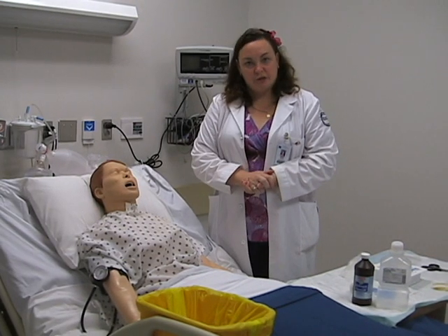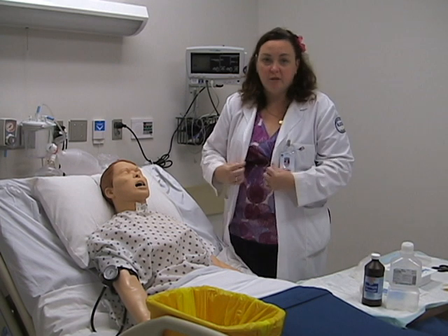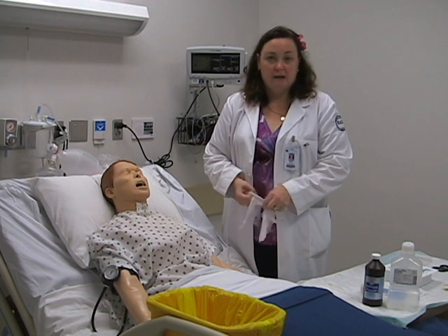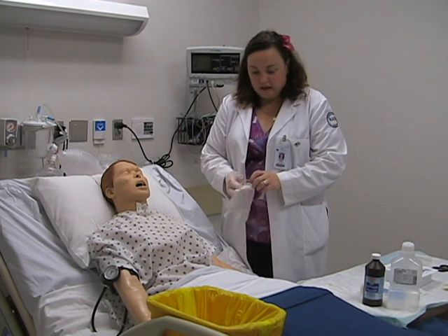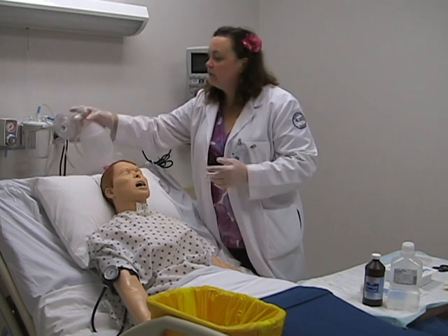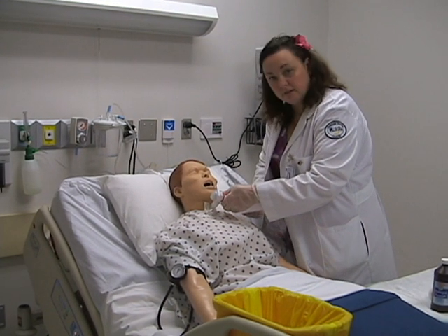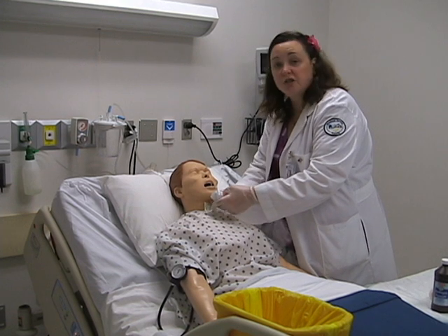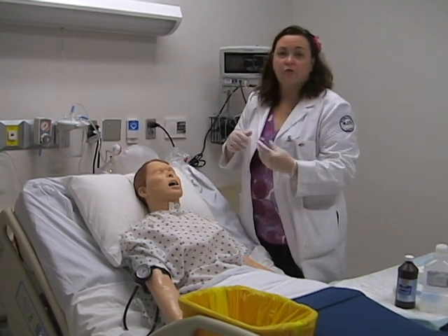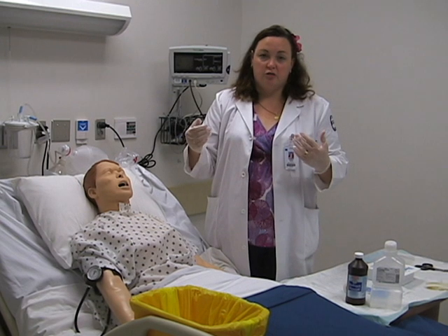When you go in to do the procedure with your patient, make sure you introduce yourself and discuss what you're going to be doing. If you want to give them supplemental oxygen beforehand, make sure you put your gloves on. Using your bag valve mask, you can attach it to the tracheostomy to give some supplemental oxygen. A lot of these patients already have a trach mist collar in place that you can use during treatment to make sure they have plenty of humidified oxygen during the change out of the cannulas.